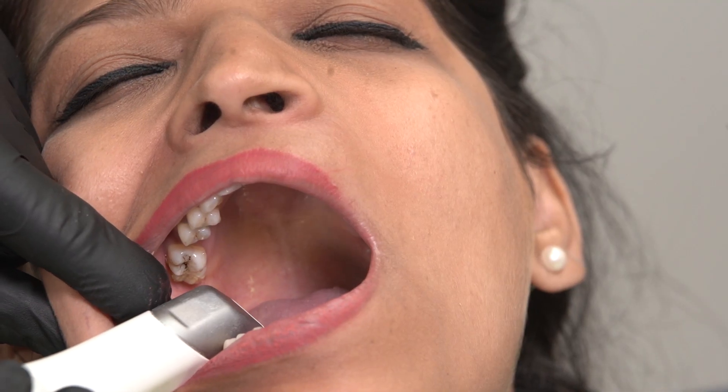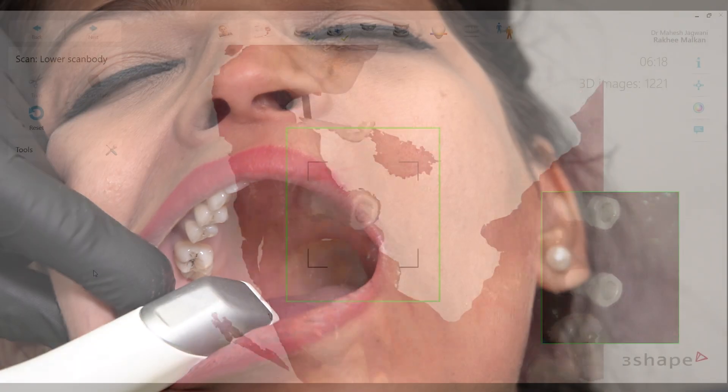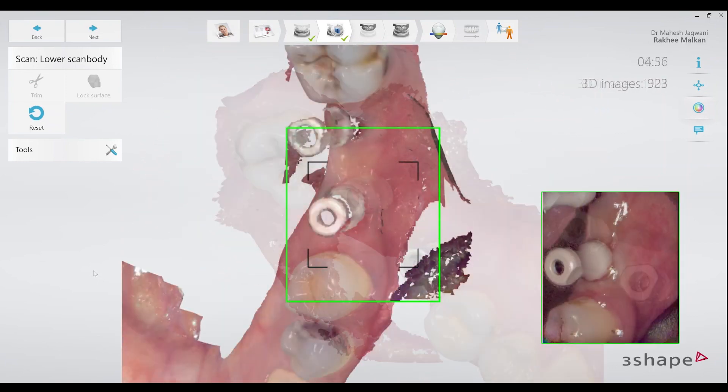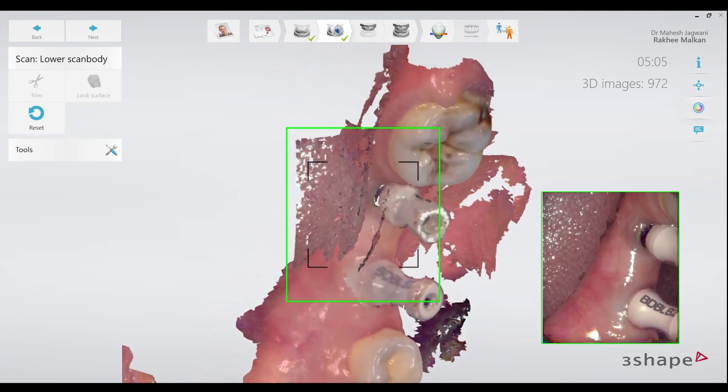All I have to do now is record the position of these scan bodies and make the scanner stitch the information to the original scan. These scan bodies will convey the 3D position of the implants to the lab with great accuracy.